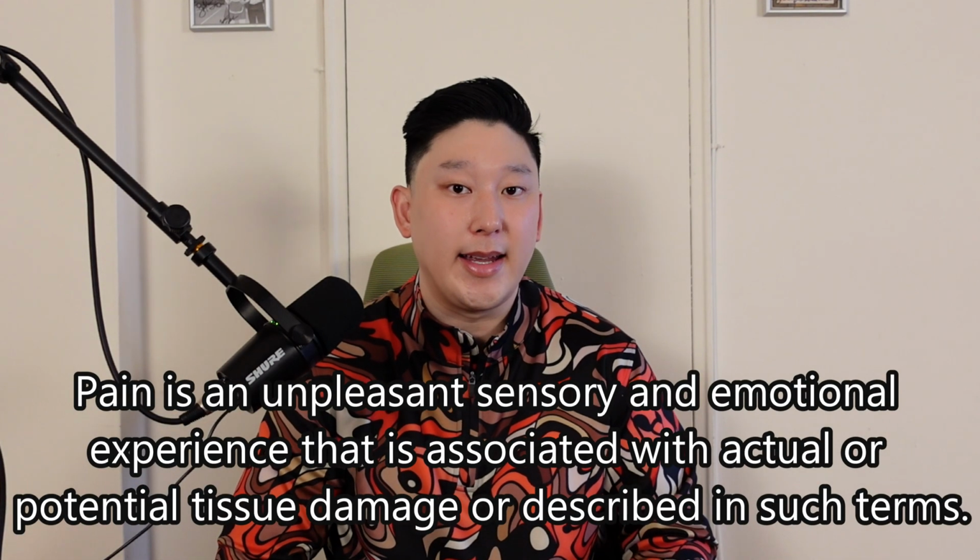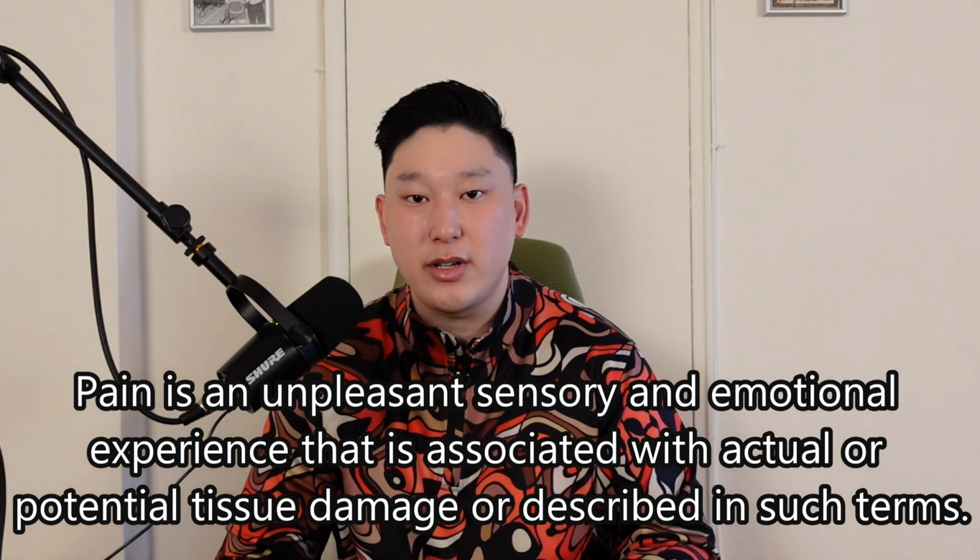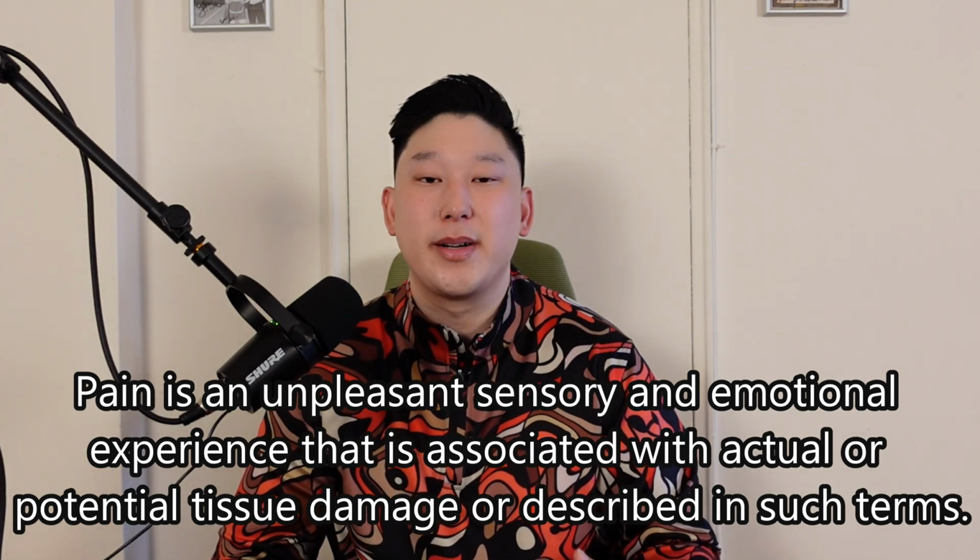And it doesn't matter which fibers you address because they all result in inhibiting sensory signals from being sent to the central nervous system, or the CNS, because unless the brain processes this information, it will not be perceived as pain. Because the definition of pain isn't necessarily that it is a result of an injury, but it is an actual or perceived injury resulting in the pain. And on the other hand, we have an increased production of hormones such as endorphins to address the pain as well. Now, there is plenty of research stating that it will address your pain short term. However, research hasn't really shown that there are long-term benefits in addressing pain.